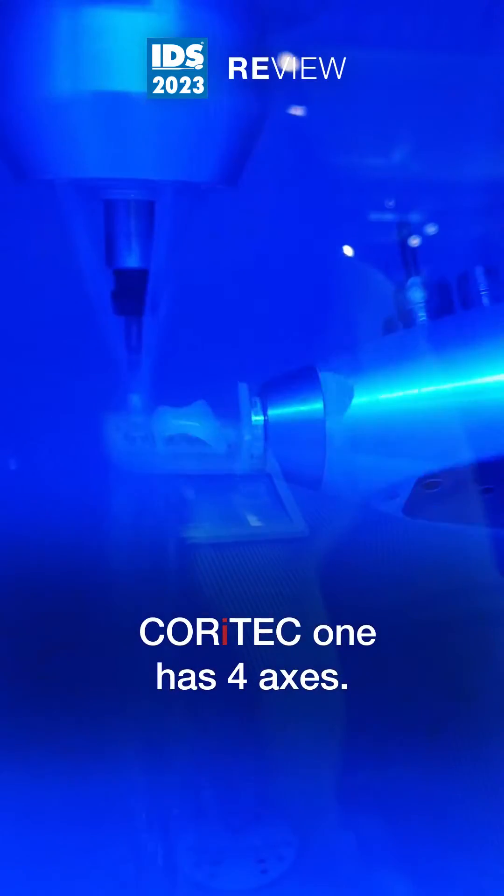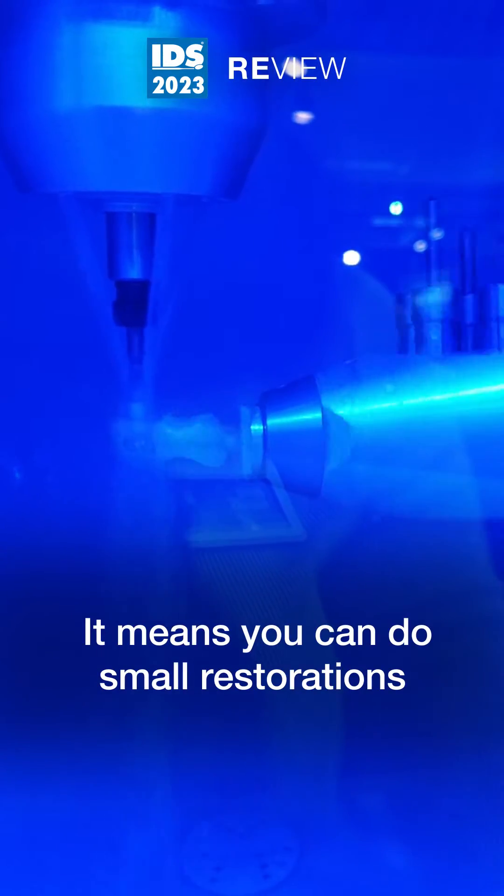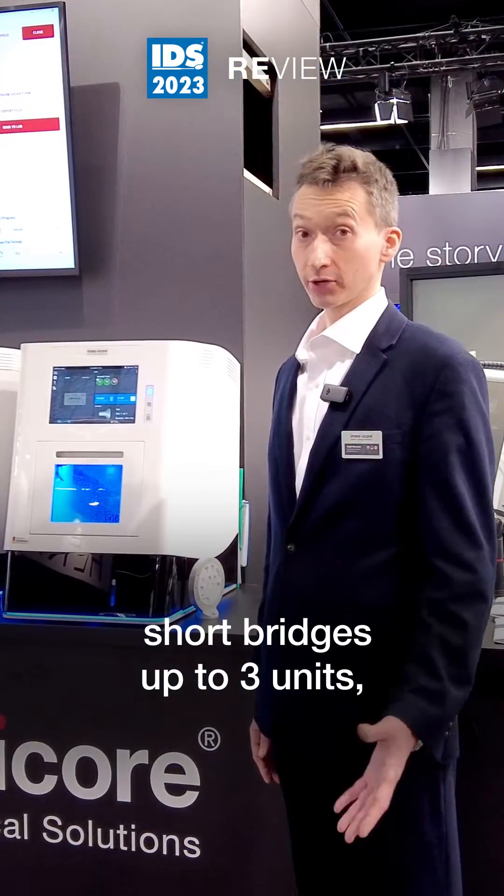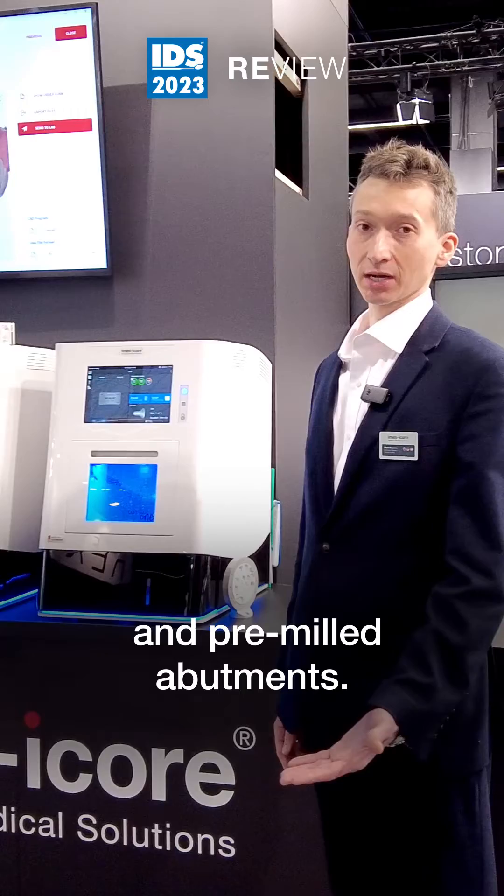CORiTEC One has four axes. It means you can do smaller restorations like crowns, inlays, onlays, shorter bridges up to three units and pre-milled abutments.